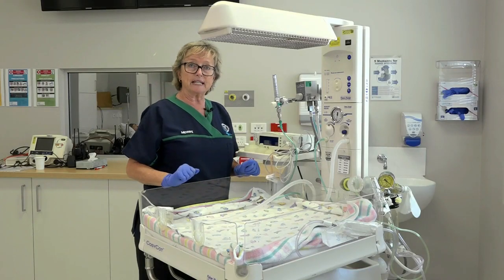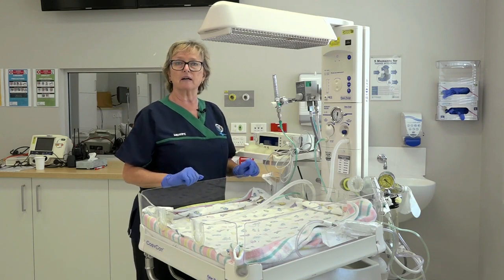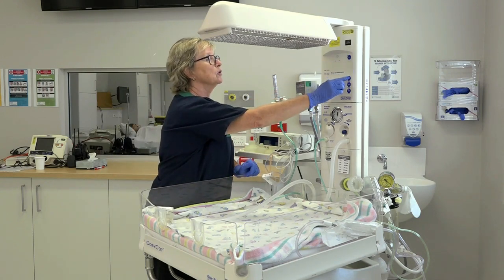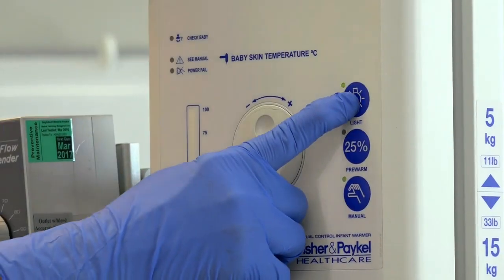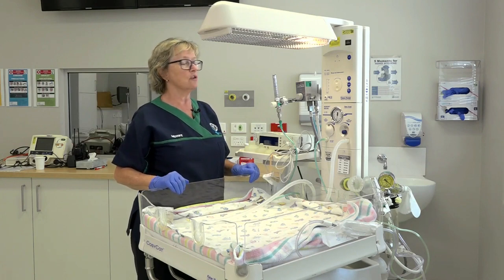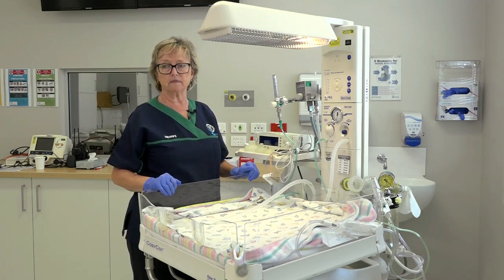We want to also see the baby, because a lot of the birth rooms are a little bit dark. So we will use the light in the cot itself, and it gives us a nice, clear vision of the baby, certainly of the cot itself.